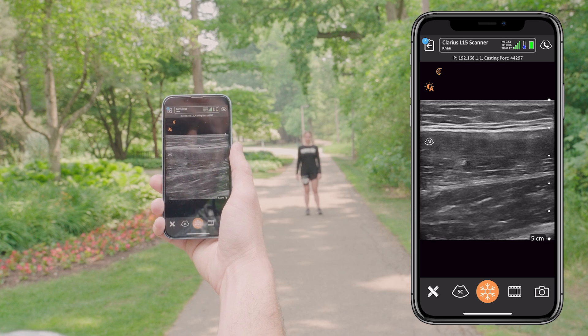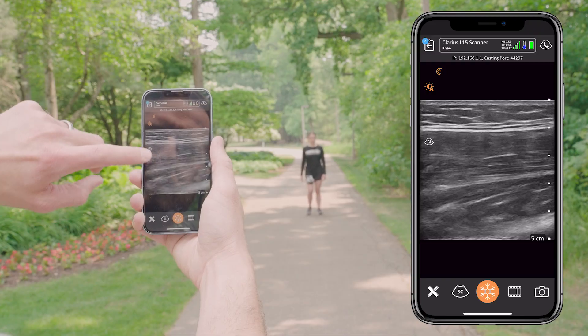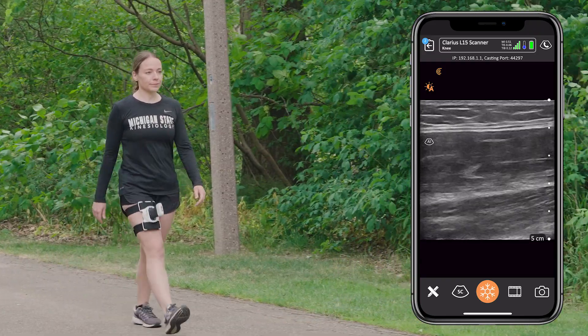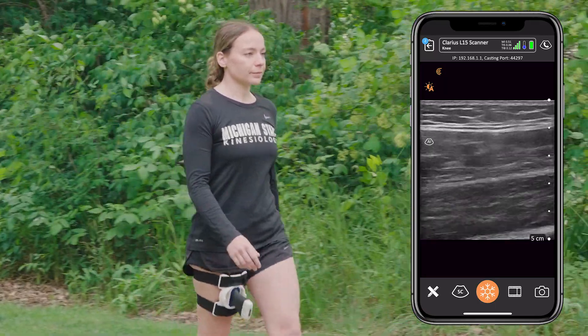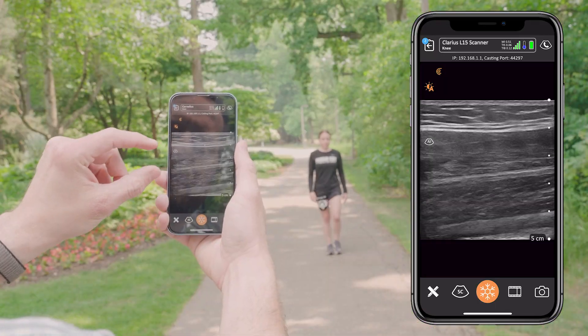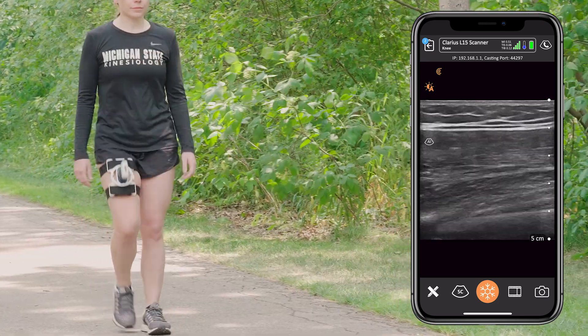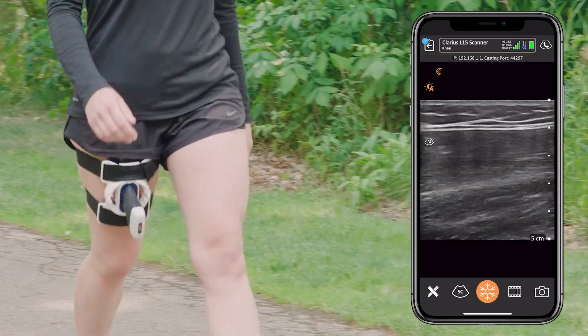Now let's move into our participant walking and us dynamically assessing our quadriceps. You can see on the Clarius iPhone app the skin and the subcutaneous fat up top, with the rectus femoris coming down here. Similar to inside, you can see on the ultrasound that the rectus femoris muscle is contracting and relaxing as she takes each step, which allows us to transfer this ultrasound technique from outside the lab to more of a real-life setting.